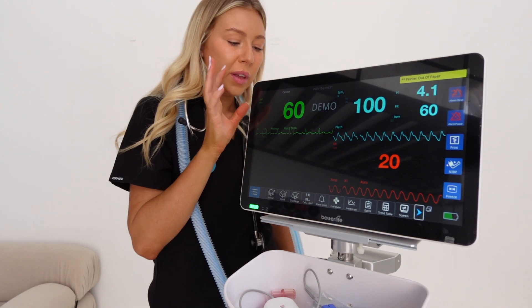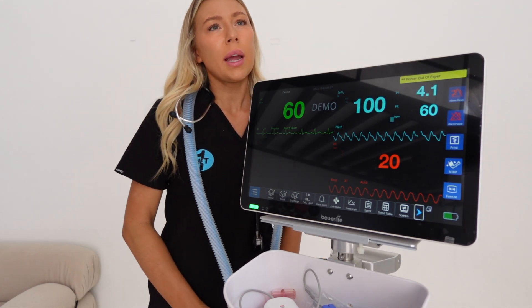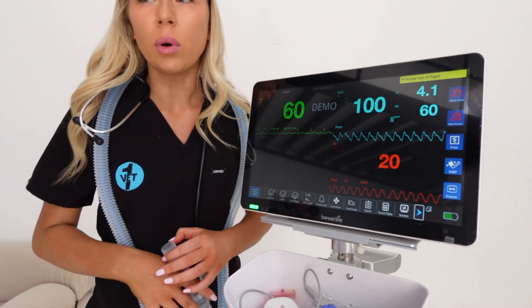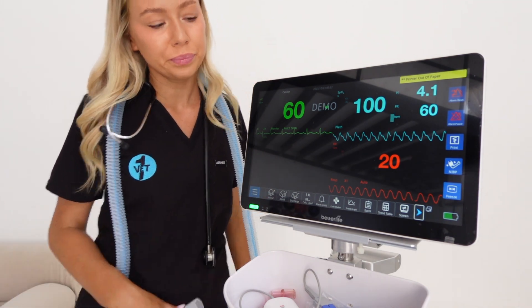Like all of these monitors, it's got ECG, temperature, blood pressure, SpO2, and you can add in capnograph as well. Capnograph used to not be as common - people weren't really monitoring it - but I think now it is a vital component of anaesthetic monitoring.